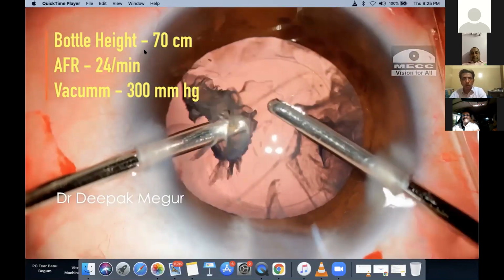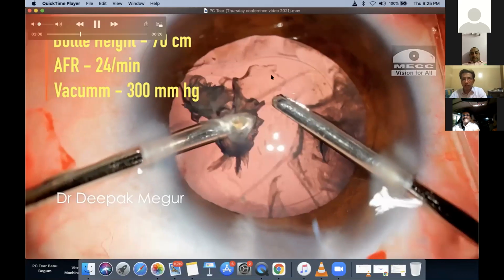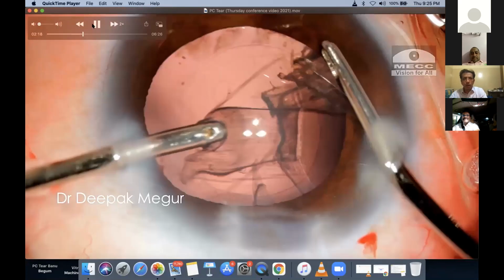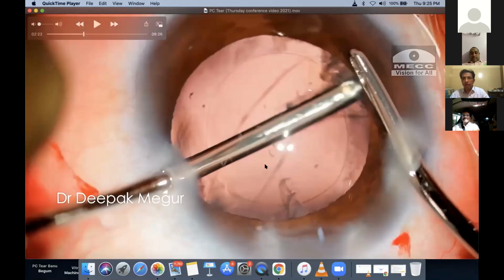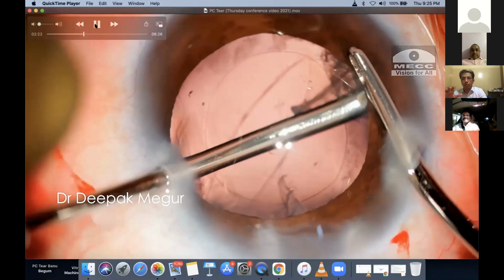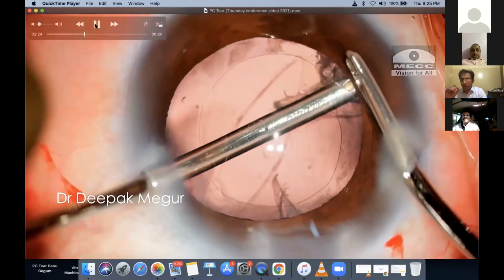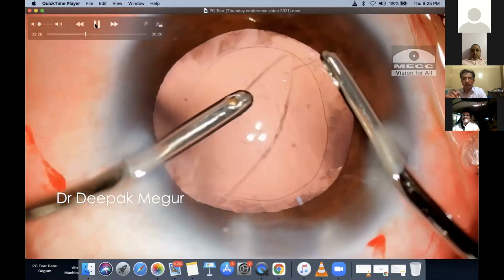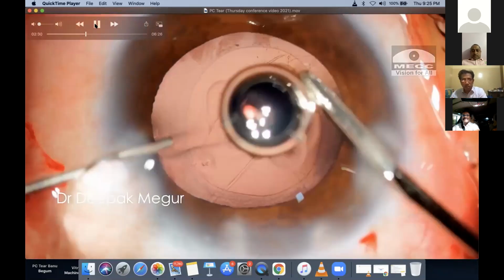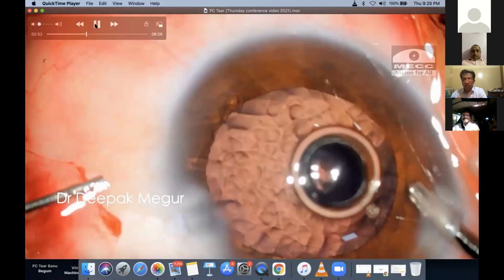And I'm able to see the rent now through and through, and this small bit of cortex is still there. A point to note here: please note the shape of the posterior capsular tear. It is just a vertical split. It's not widened. If it is widened, then it's a surefire indicator that the vitreous has already prolapsed. So that is one clear-cut indication that the anterior hyaloid face is still intact. Again, you don't want the chamber to shallow. Inject viscoelastic and come out.